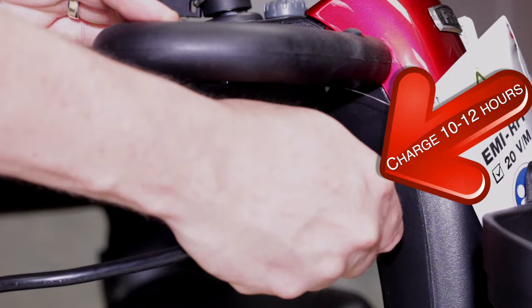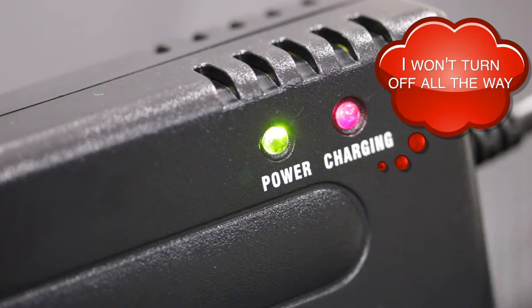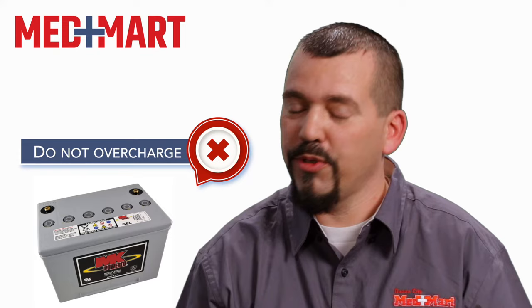The other thing that's important is to remember that none of these chargers have an automatic shutoff. So some people have the idea that they're going to just plug it in and leave it plugged in indefinitely so that it's always charged. You can't do that because you can burn the cells up in your battery and ultimately ruin the battery.